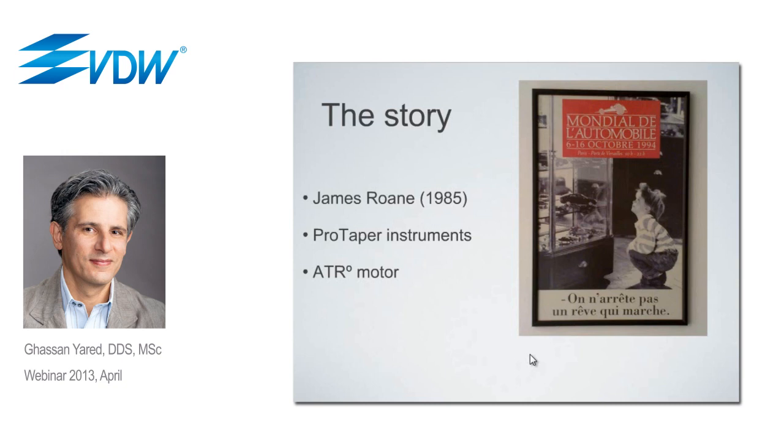Then later, I was testing prototypes of ProTaper instruments, and I knew that the ProTaper instruments can also cut in reciprocation. And at the same time, ATR, a company that was based in Italy, used to manufacture the ATR motors.